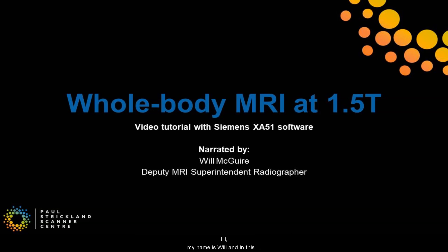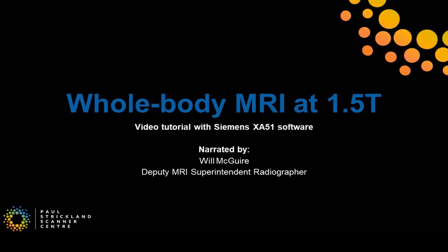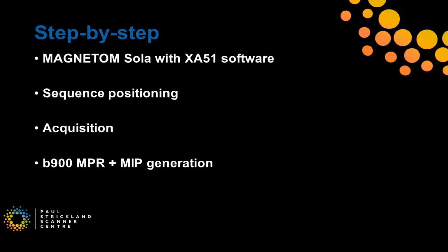Hi, my name's Will and in this video we're going to look at how to perform a whole body MRI at 1.5T using the Siemens XA51 software. I'll talk you through sequence positioning, scan acquisition, and creation of b900 MPRs and MIPs.